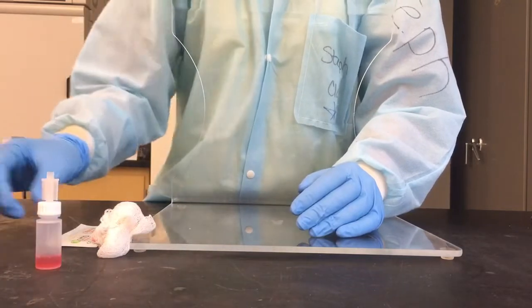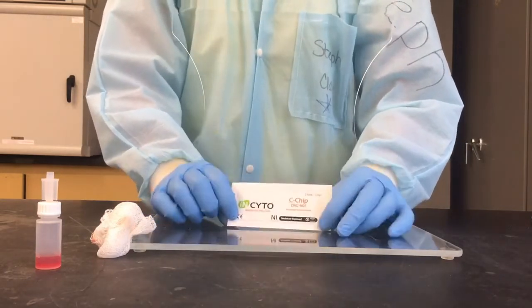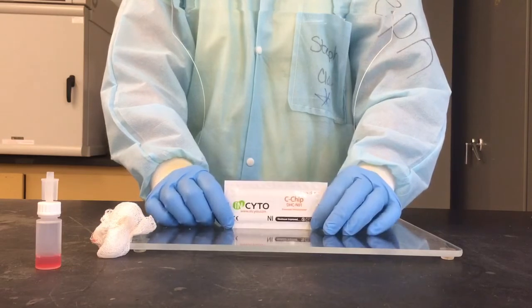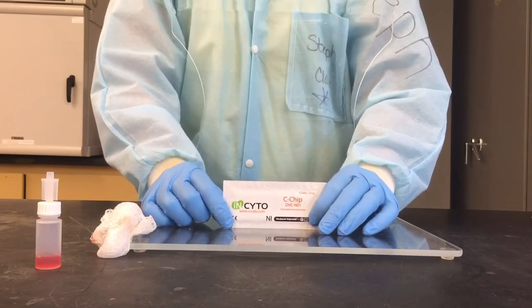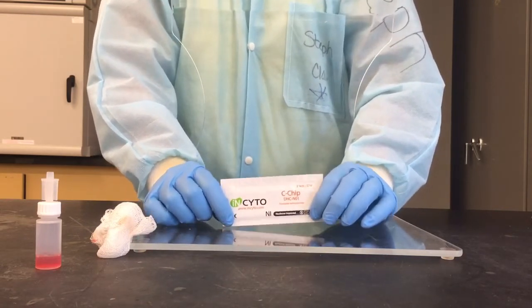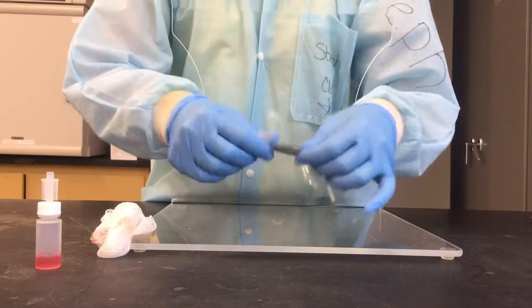Once your 10 minutes are up, then you are going to grab one of these disposable hemocytometers that I'm trying out this year. The disposable hemocytometers are nice because you don't have to worry about cleaning them before you use them or after you use them. You use them and then you get to throw them away. But the not quite as friendly part about these hemocytometers is that it can be difficult to find the grid on them. So when we go over lab at the start of class, I will go through some tips to help you be able to find them, but if you're having trouble finding them, I can guarantee you that you're not going to be alone.